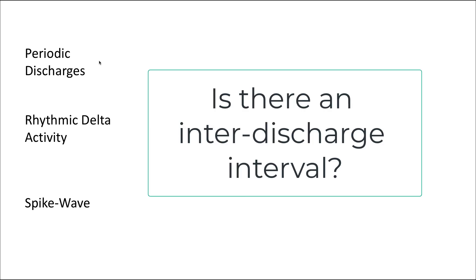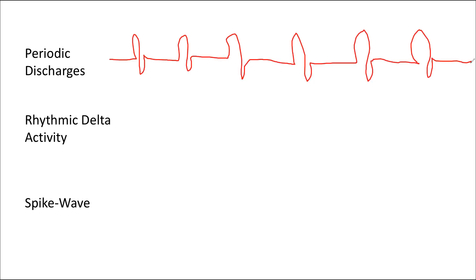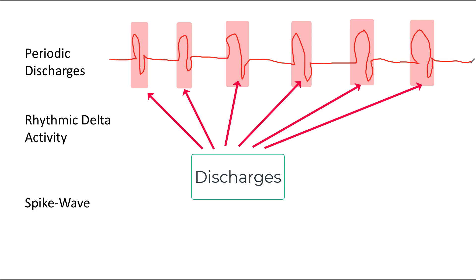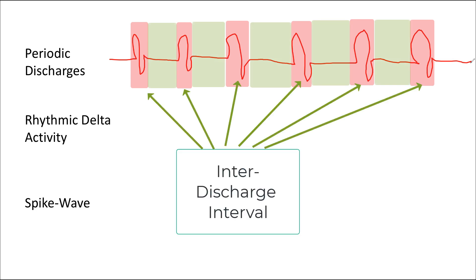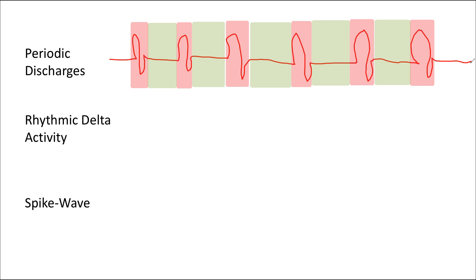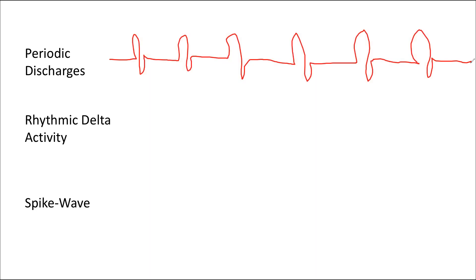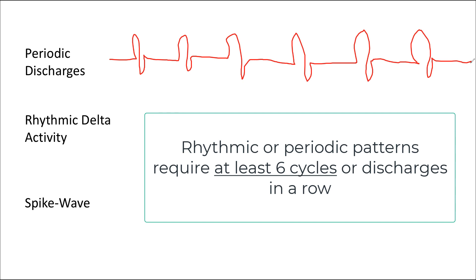It can be very difficult for learners to distinguish between periodic discharges, rhythmic delta activity, and spike wave activity. But the most important thing is the presence or absence of an inter-discharge interval. Periodic discharges consist of discharges that may have varying morphologies and levels of complexity separated by a clear inter-discharge interval. Another important element is that you have to see six cycles or six examples of these patterns in a row for it to qualify as a rhythmic or periodic pattern.